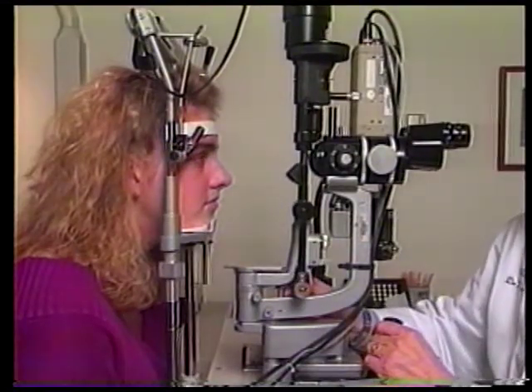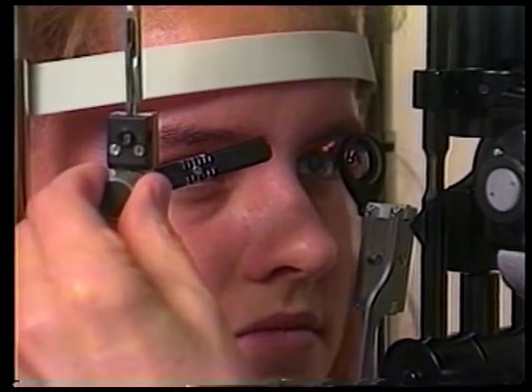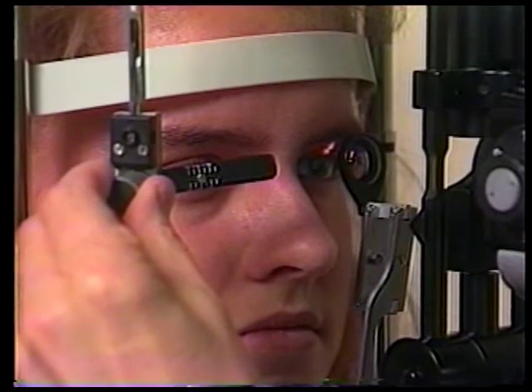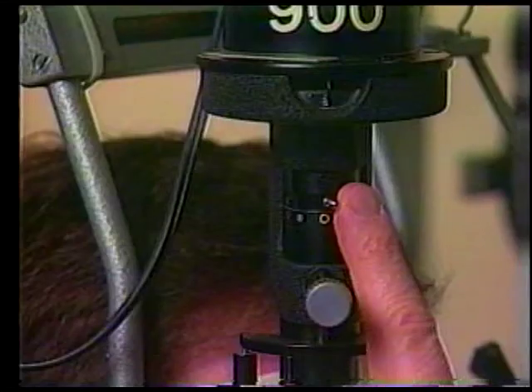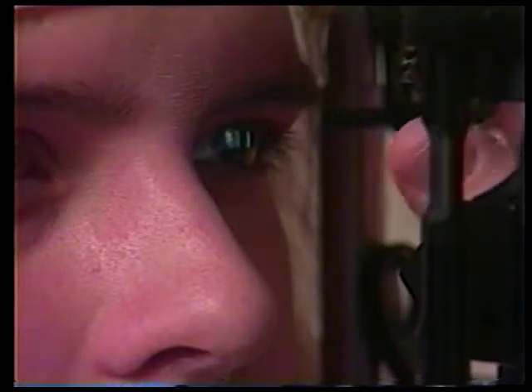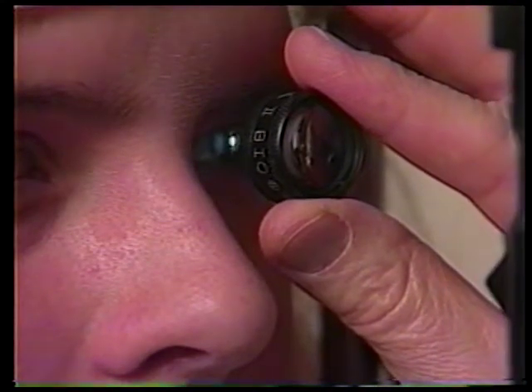Initially, the slit beam should be coaxial with the microscope for fundus biomicroscopy. The fellow eye must be steadily fixing on some target. This is the best time to use the fixation target coupled to the slit lamp. The 90-diopter lens exam starts with a coaxially aligned slit beam focused on the cornea. The 10% gray filter should be used to reduce the risk of light toxicity to the retina. Introduce the 90-diopter lens in the light path in front of the eye while bracing your hand on the patient's forehead. Slowly pull the joystick back and a slit fundus red reflex will come into focus.